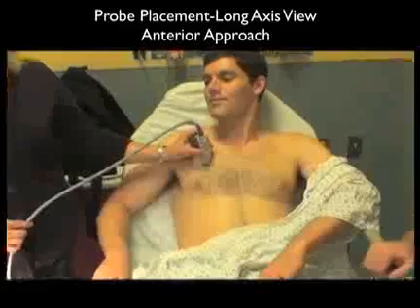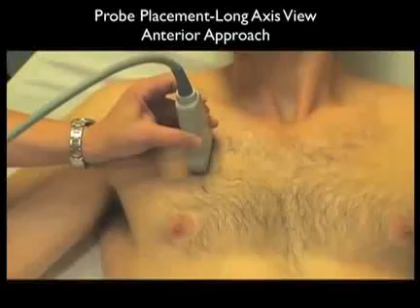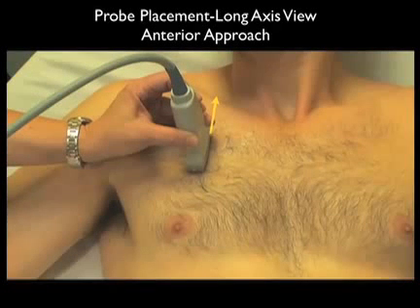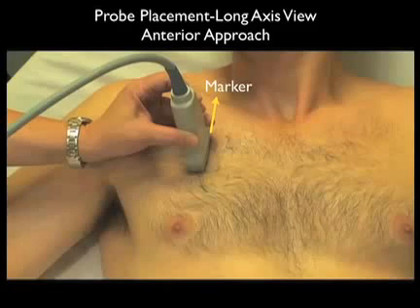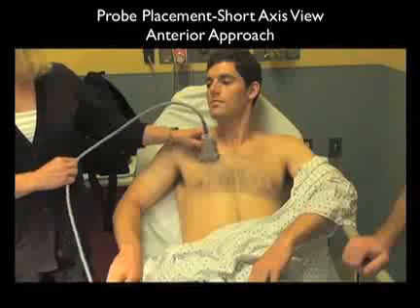Here we have the high-frequency linear array probe positioned on the anterior chest wall at about the mid-clavicular line, looking into about intercostal space 3. In most cases of pneumothorax with the patient supine, the air would be predominantly seen in this area. Note we're looking at a long axis configuration between the ribs with a marker dot oriented superiorly towards the patient's head. Once we've identified both the ribs and the pleura, we can swivel the probe into the short axis configuration to further look at the pleura and to detect pneumothorax.